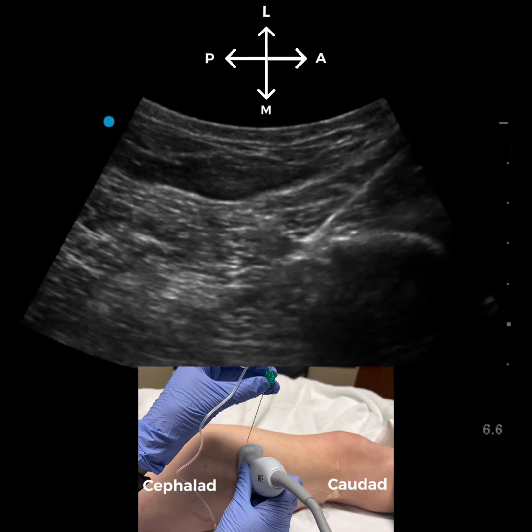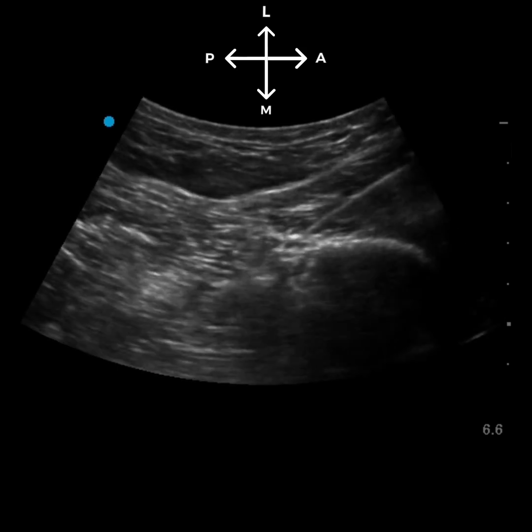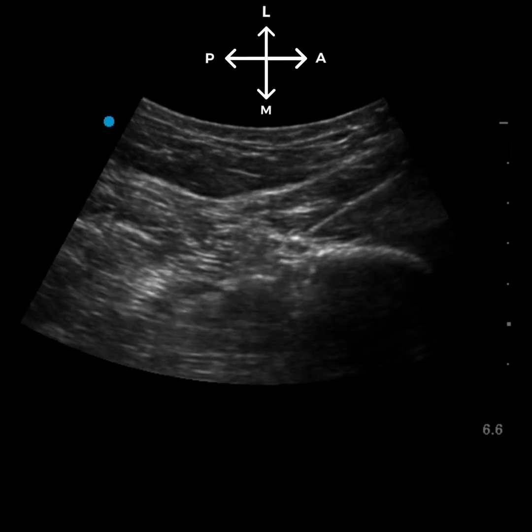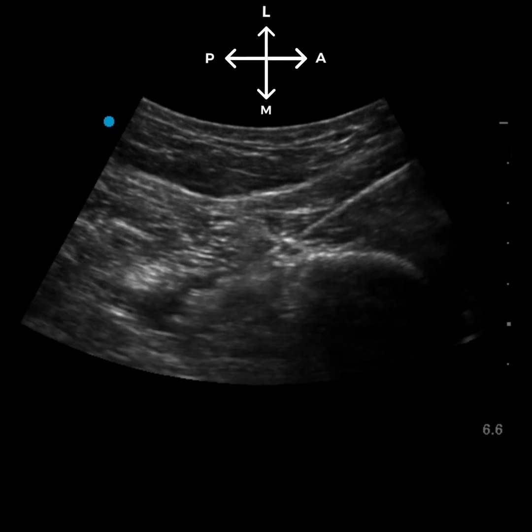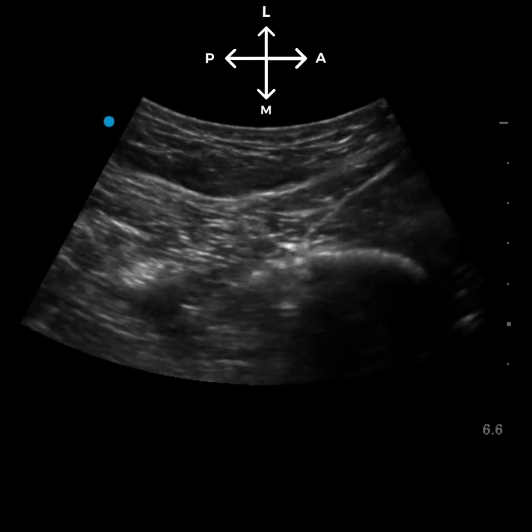Our needle will enter in an anterior lateral to posterior medial direction towards the nerve. We'll pop through the fascia of biceps femoris and give a test injection. After confirming we're in the right spot, we'll switch to our local anesthetic. In adults, we'll administer about 20 to 30 mls of local anesthetic, like we would for a traditional popliteal sciatic nerve block.